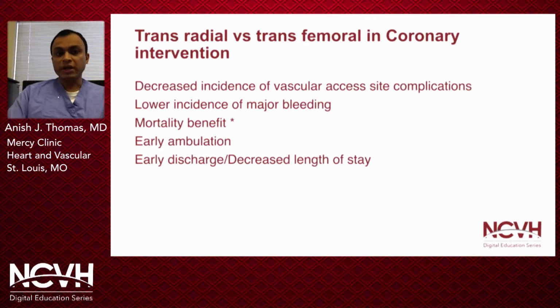If you compare the transradial approach to the transfemoral approach in coronary interventions, we do know that there's a decreased incidence of vascular access site complications, a lower incidence of major bleeding, potentially a mortality benefit, definitely early ambulation and early discharge, and decreased length of stay.